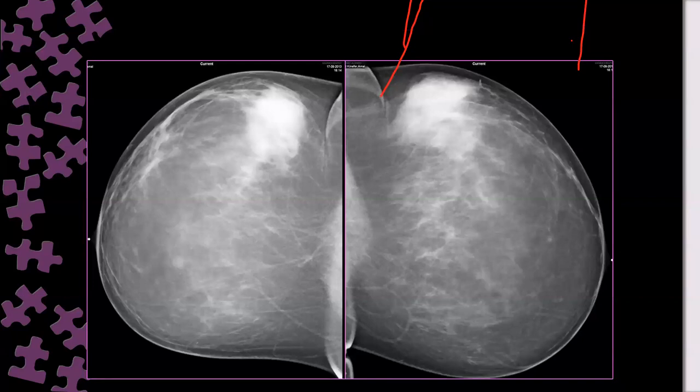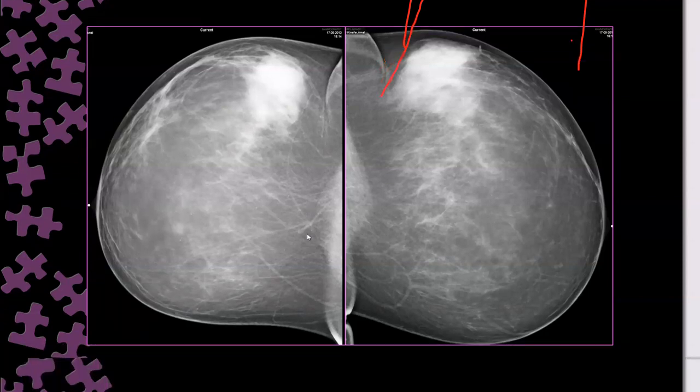What about this? This is also my patient. I thought you would just give it a pass or recall. Skin fold, not very big. It's acceptable. You are not going to recall. I can see the nipples in profile bilaterally, and the pectoralis. Profile central, and we can see the pectoralis, and even the retromammary fat, medial and lateral.